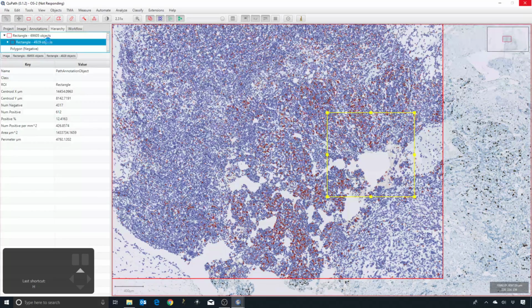view. And so in the next release, you'll be able to optionally turn on or off whether or not all of the cells are there, because this particular component of the user interface can cause a bit of trouble in performance whenever you start to manipulate it too much. You put too many objects within your hierarchy, then you can have these pauses like what we're seeing at the minute as QuPath tries to resolve it.